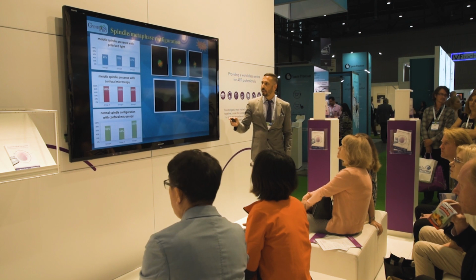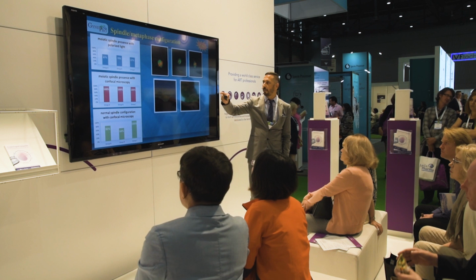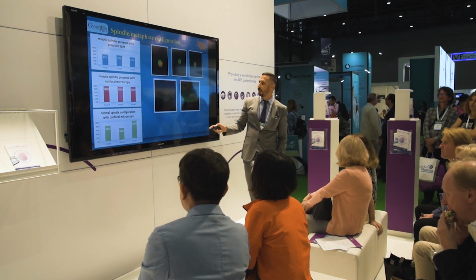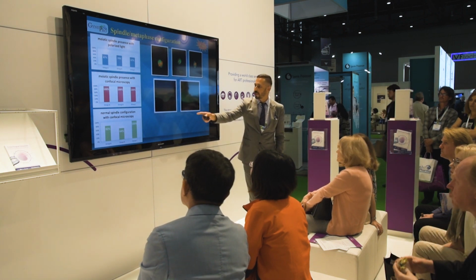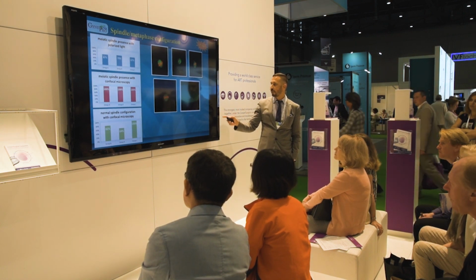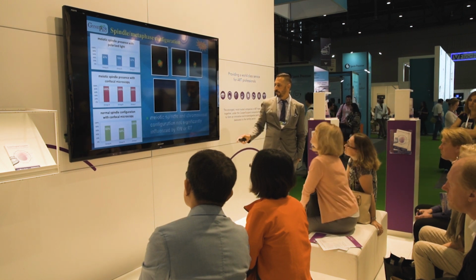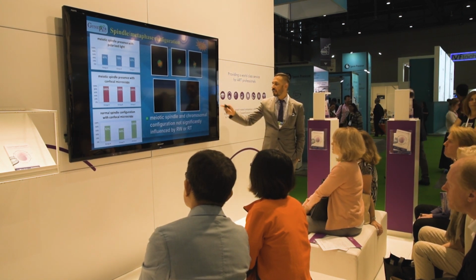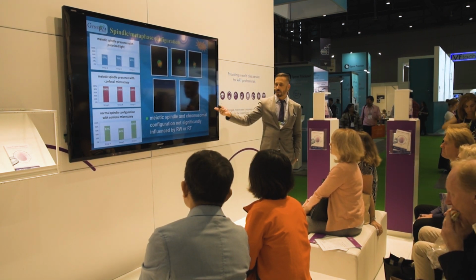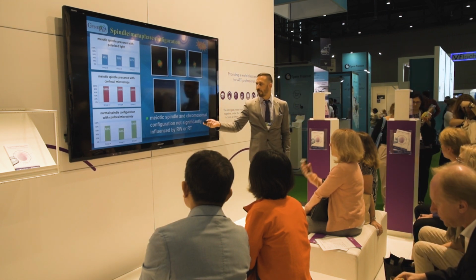Again, the spindle, we did not observe any significant difference on spindle presence, both when it was observed by polarized light or confocal microscopy. Neither did we observe any difference in normal spindle configuration within the 3 groups. This is a normal spindle, this is our normal spindle. So this means that by removing the cryoprotectant very quickly, also on slow frozen oocytes, we did not observe any negative effect.